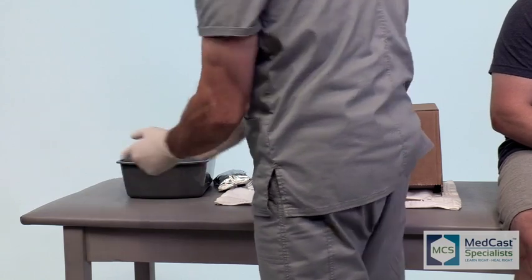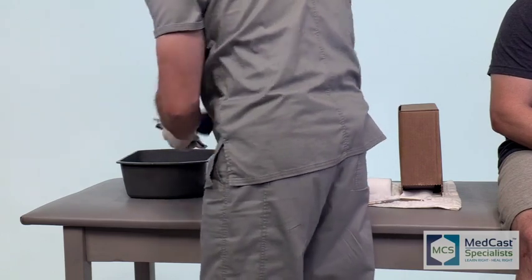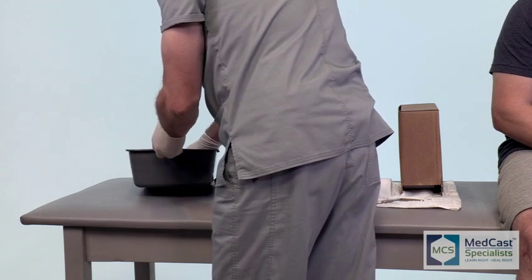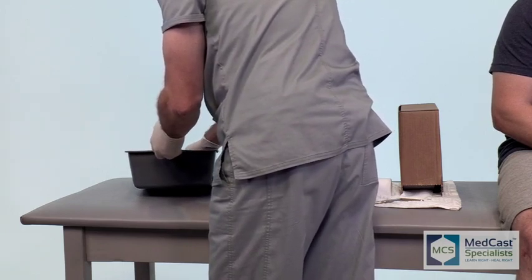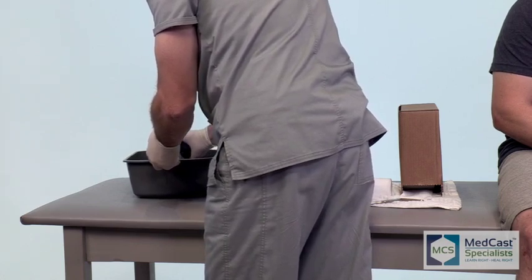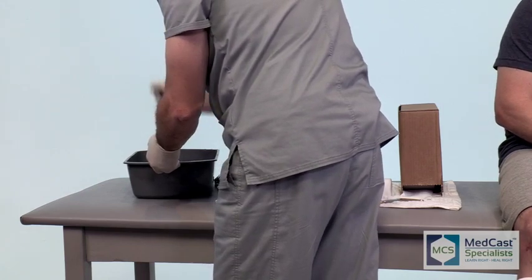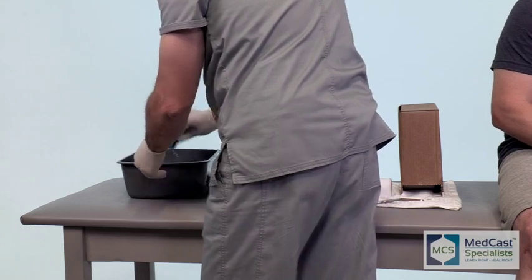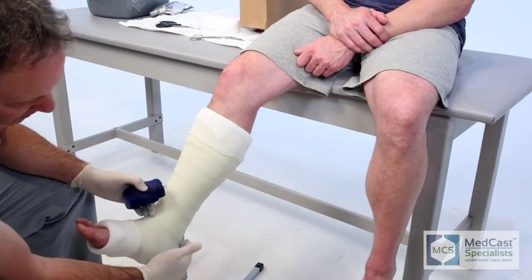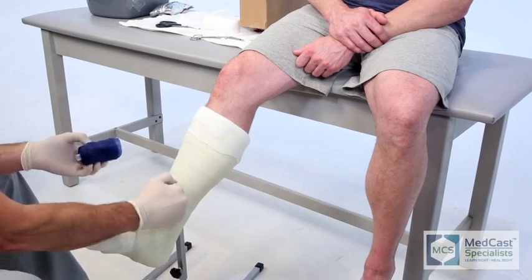This is your final roll and we call that the money roll, because this is the one that they actually pay for. Put a little more effort into your money roll and make it look good for the patient — spend a little bit of time to smooth it out and make sure there's no edging on the distal or proximal end of the cast. It's important to make sure you let that water completely saturate into the plastic on that cast tape; wait for all the bubbles to stop coming out, because you want to make sure it has all the resin completely wet so it will adhere to the fiberglass.